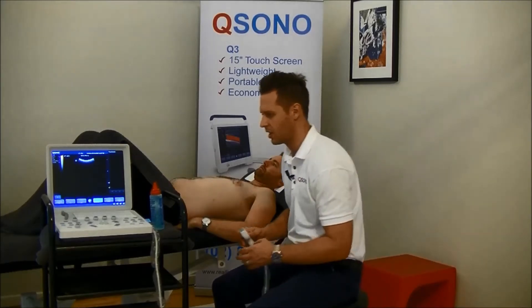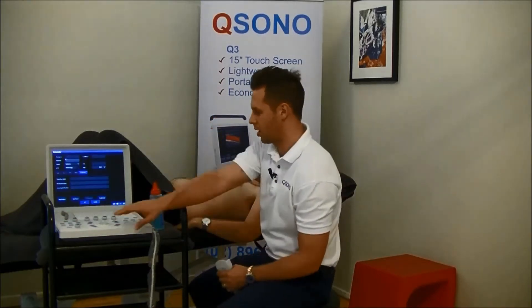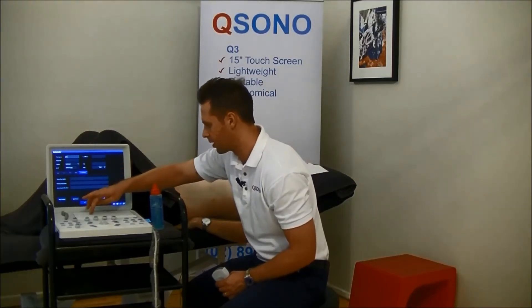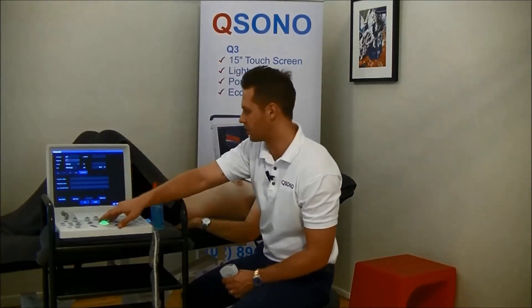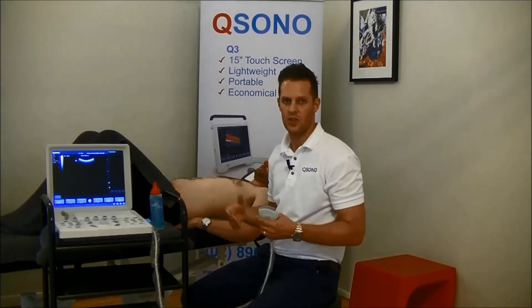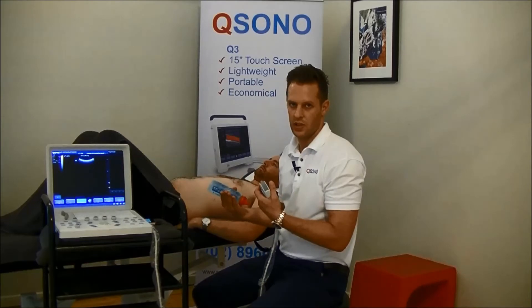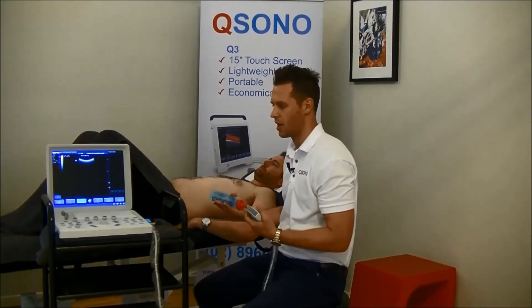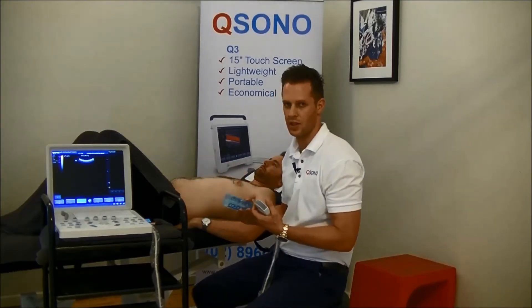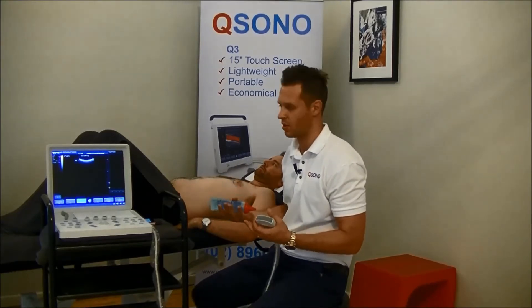The very first thing we're going to do is set up our patient. If we hit this little patient button here on the Q6 unit, we can enter a name, and that's going to allow us to go back and have a look at these images over time to see how the patient's improving. Apart from just being able for us as physios to see what the transverse abdominus is doing on ultrasound, it's also a really good tool for patients to see what's happening on the inside for specific muscle contractions and to understand whether or not those muscles are working properly.